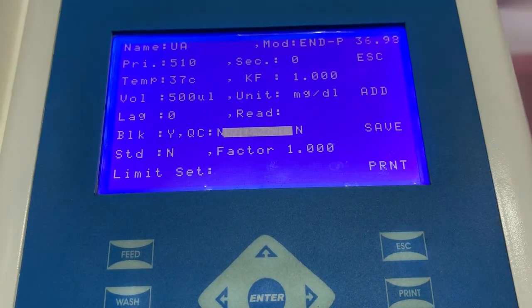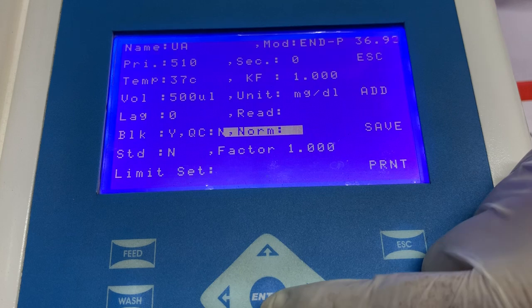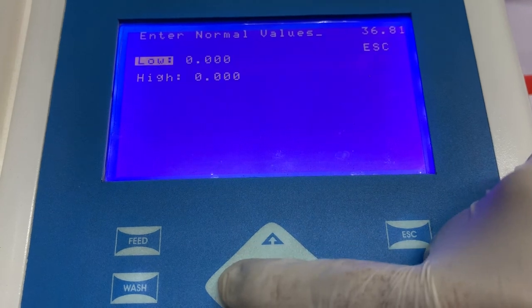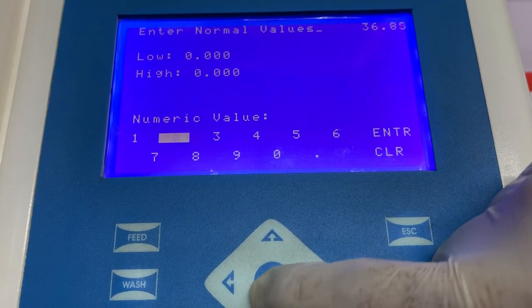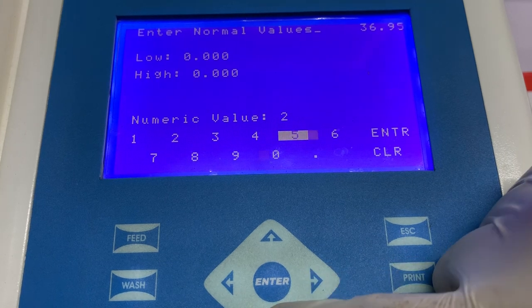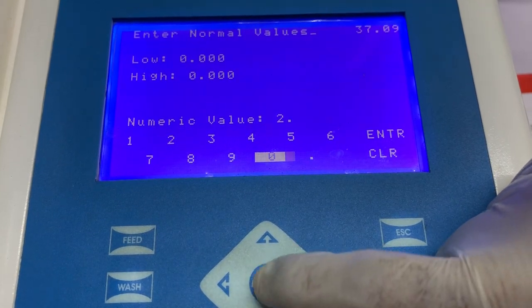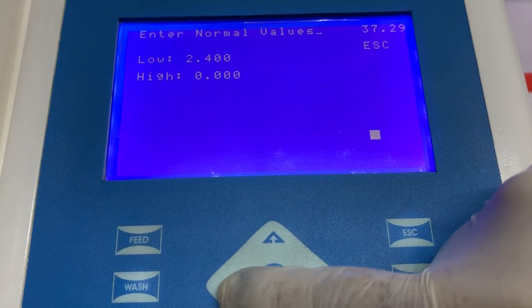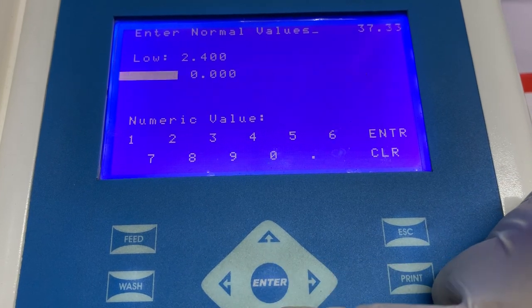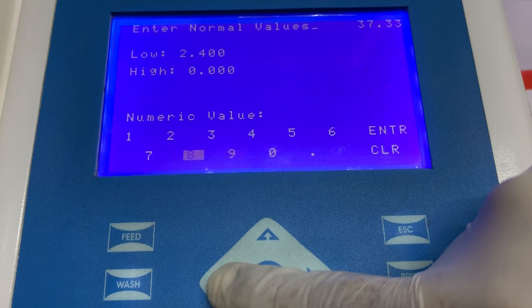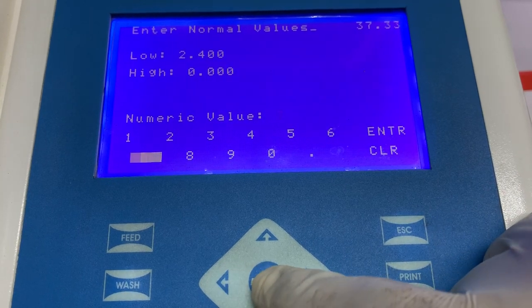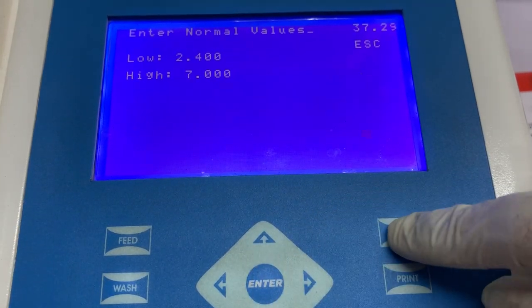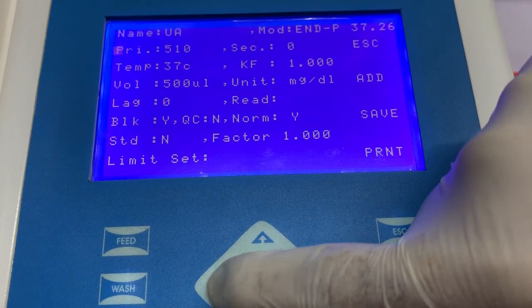In this case, you have to enter the lowest and the highest value as per the instructions for use. Select the option of normal range and select yes. Next, select the option for low and enter the lowest value mentioned in the instructions for use. Press enter once you have entered the value. Next, select the option high and enter the highest range mentioned in the instructions for use. Once you have entered the value, press escape to come back to the home screen.